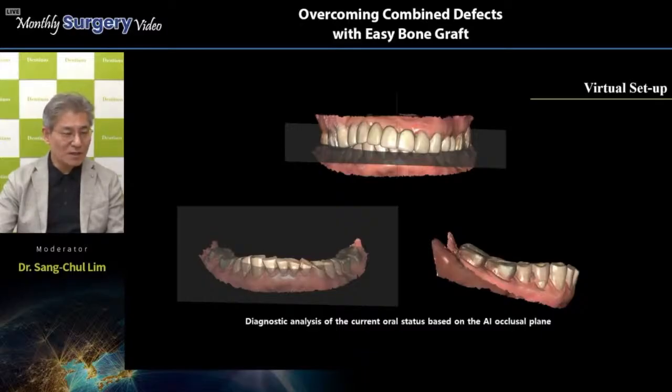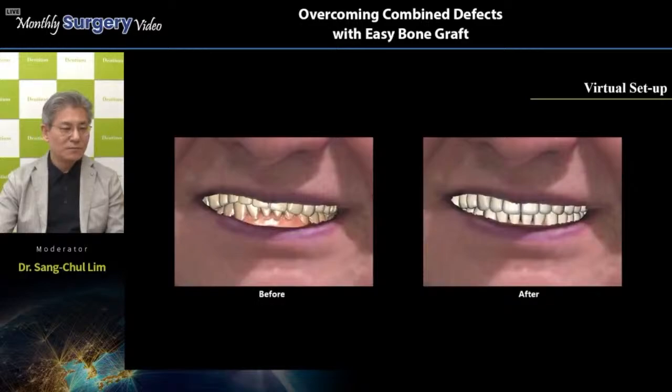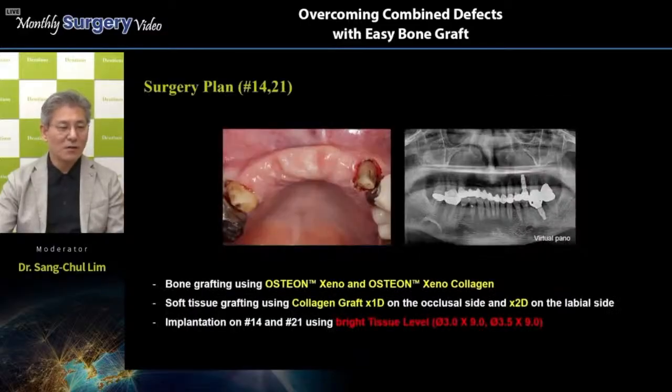After the virtual setup, we can see the lower anterior has some problem, right? So these areas also should be corrected for the proper occlusal scheme. Before, after. So this is the after-treatment photo. That is our aim, our final goal. So for this purpose, some treatment procedures were decided.